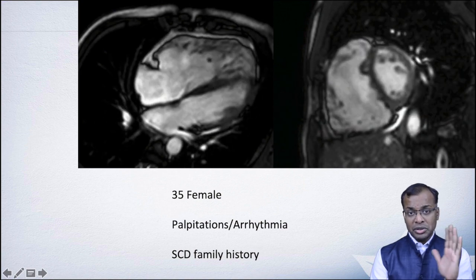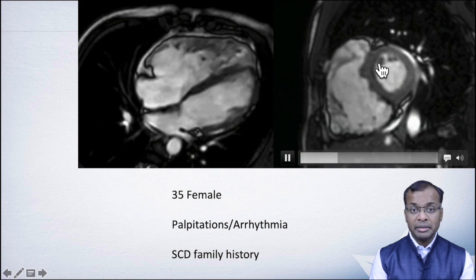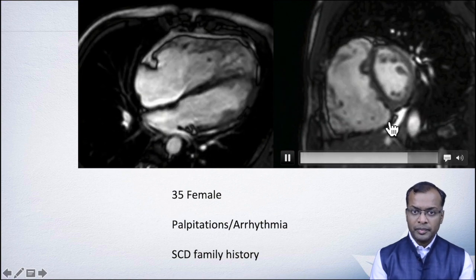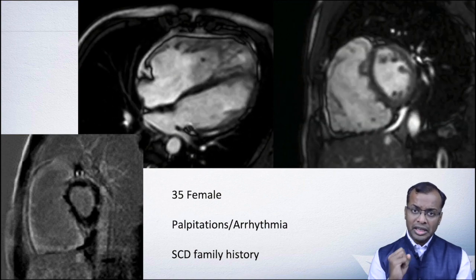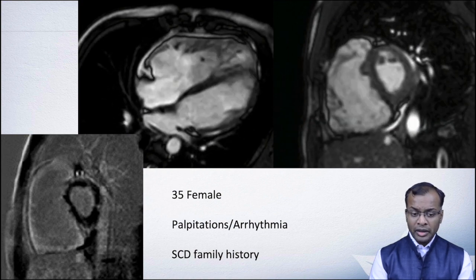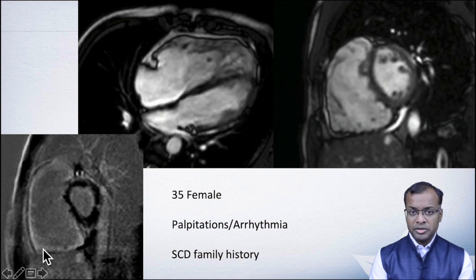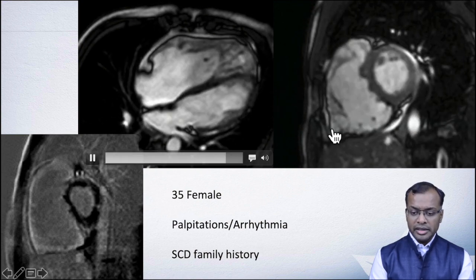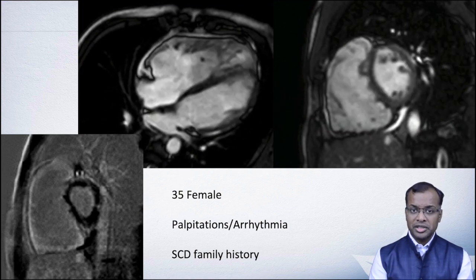Now the same patient, when we do a short axis view, the RV free wall dyskinesis becomes very, very apparent, and you can see it is not at all contracting in a synchronous fashion. We also do delayed enhancement imaging. By that we mean we give contrast, and about 7 to 10 minutes after giving contrast we start doing imaging. The areas where you can see this bright enhancement or contrast deposition are usually suggestive of fibrosis within the myocardium. So this was another case of ARVC. MRI was satisfying one major criteria for ARVC.